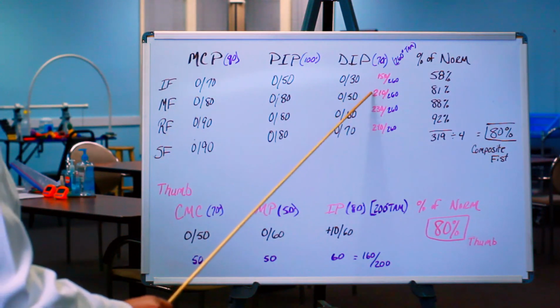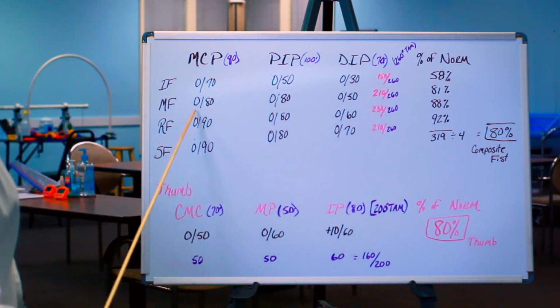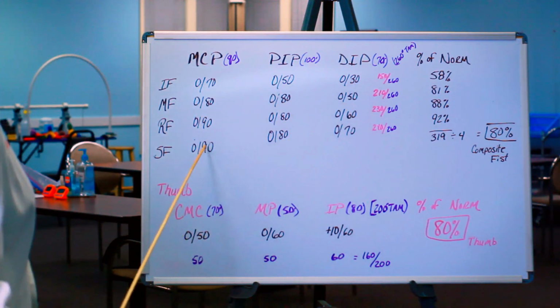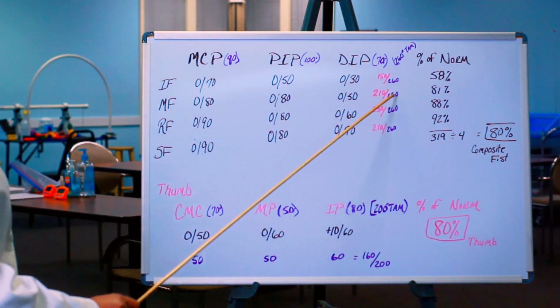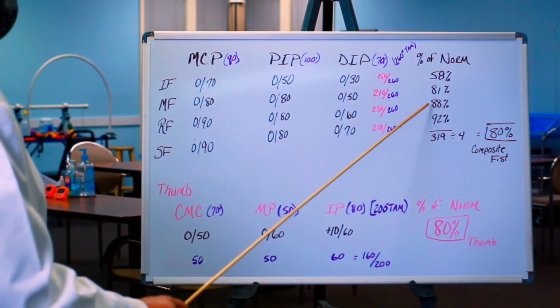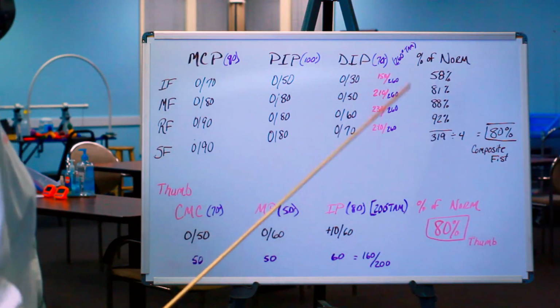The tally here is 210. That's 80, 80, and 50. Ring finger, add 90, 80, 60, 230. Small finger, 90, 80, 70, 240. Now, when you do the computations, 210 divided by 260, 81%. 230 divided by 260 is 88%. 240 divided by 260 is 92%.